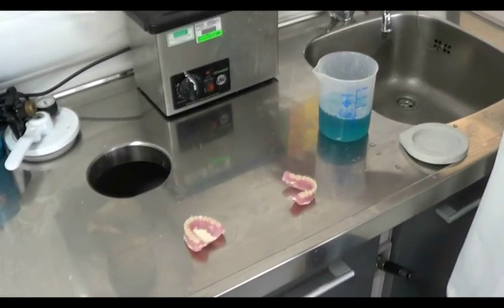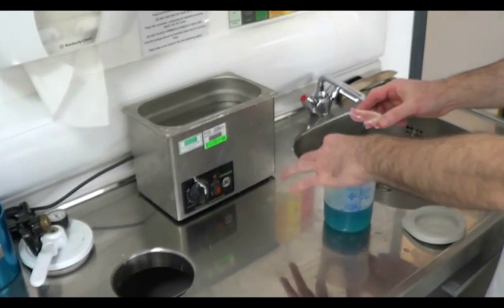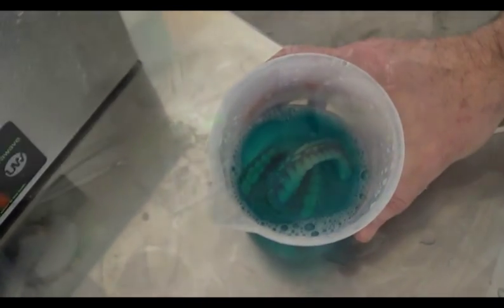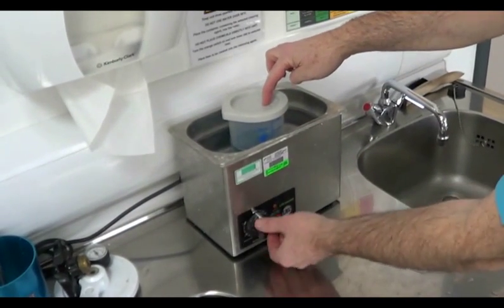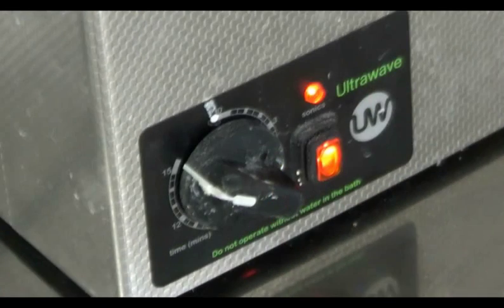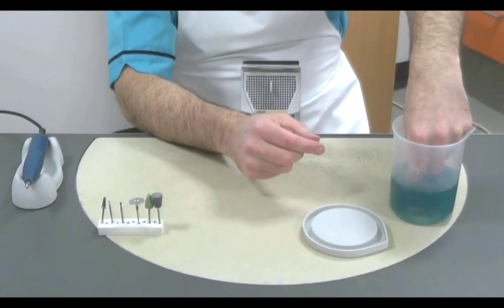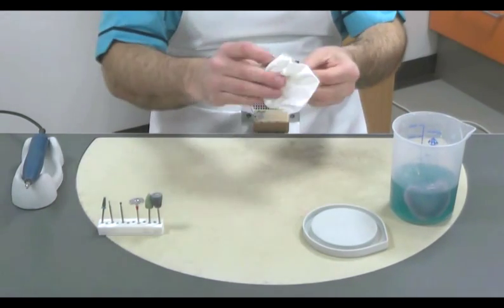To assist in the removal of any fine debris from around the surfaces and spaces, we place the dentures into an ultrasonic bath contained within a plastic beaker filled with a chemical plaster remover. The ultrasonic bath should run for about 10 minutes. After 10 minutes, the dentures can be removed and dried.